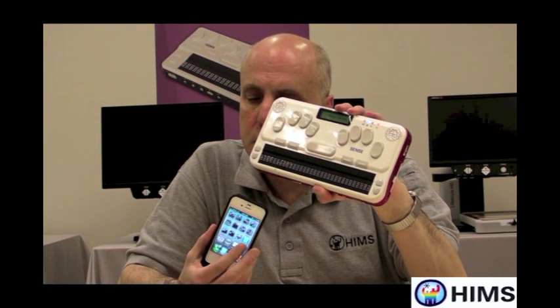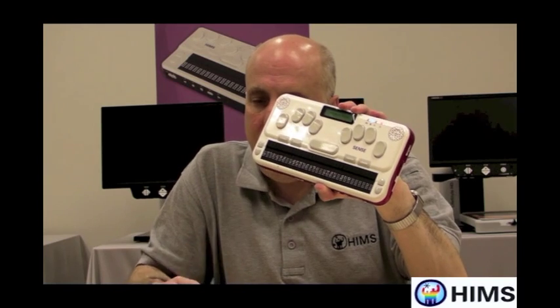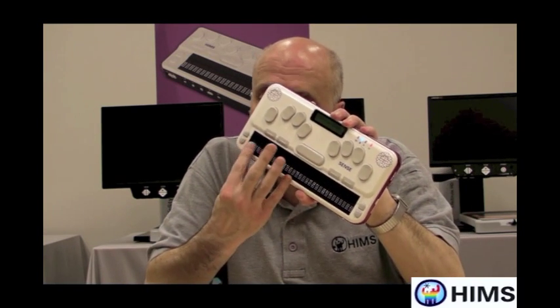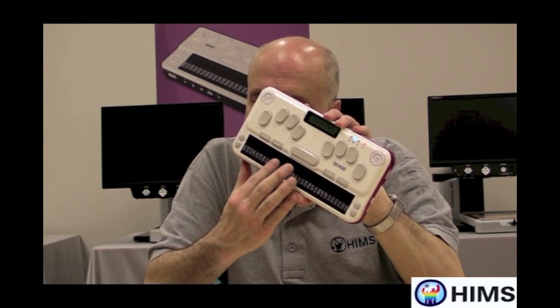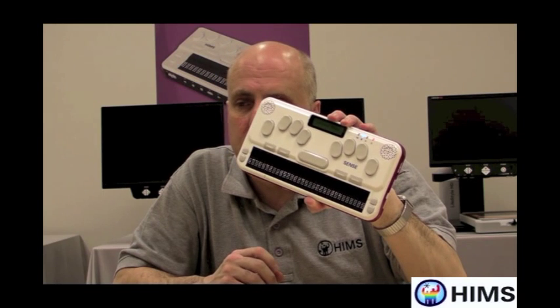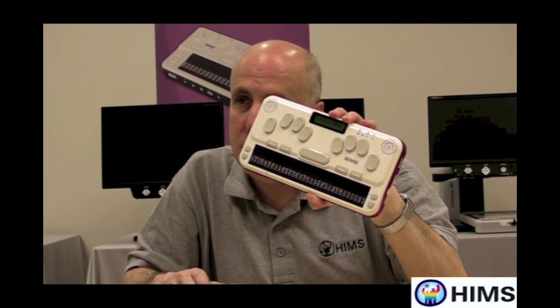And the Braille display is keeping up with my iPhone. So I'm going to flick right, and as I'm doing the flicking right or left, the Braille display keeps right up. In fact, it says the word 'calendar' right there. So everything is in Braille now as it is on my iPhone.